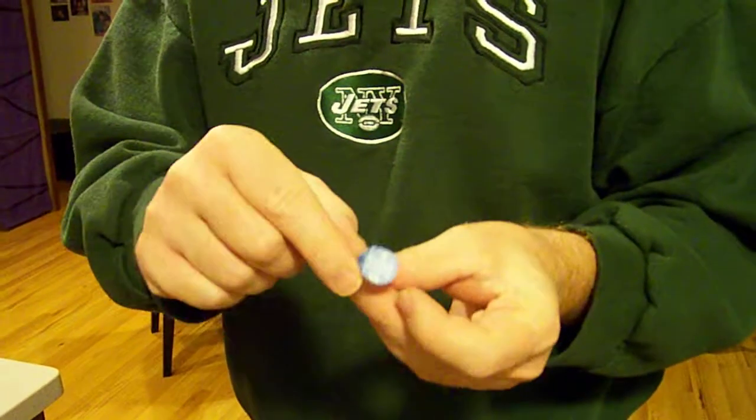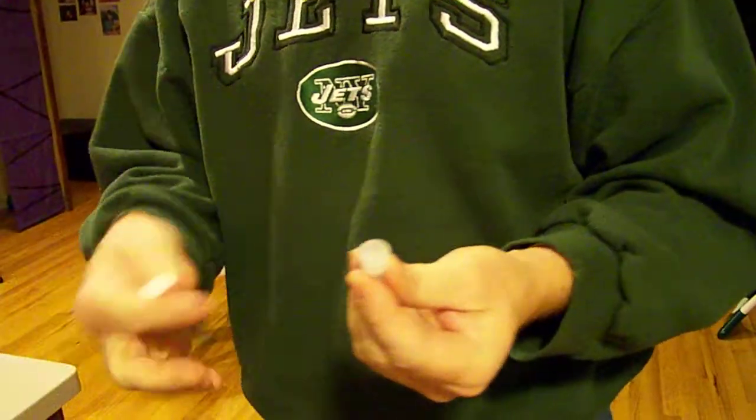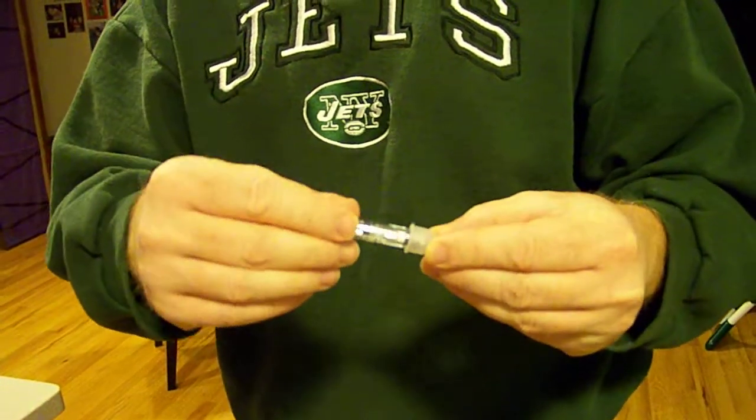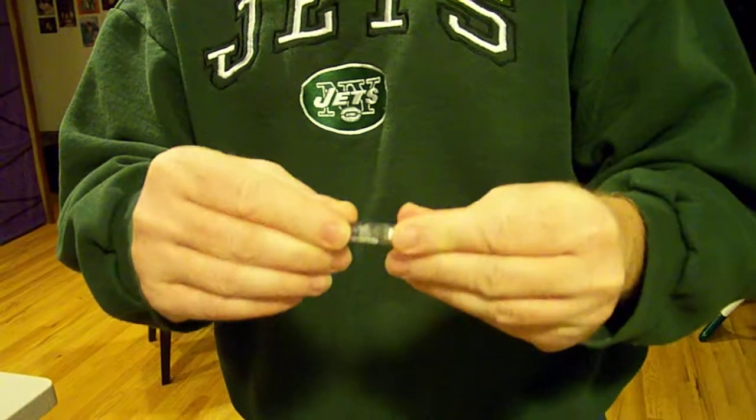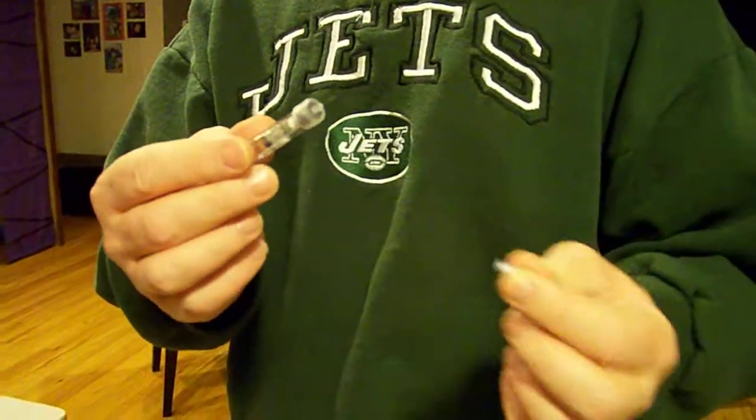Take out the syringe, take the tab off, screw it on, lift the top off, take the cap off the needle.